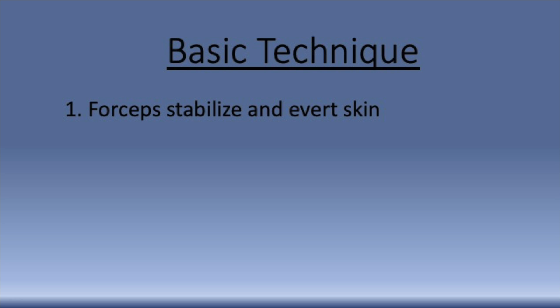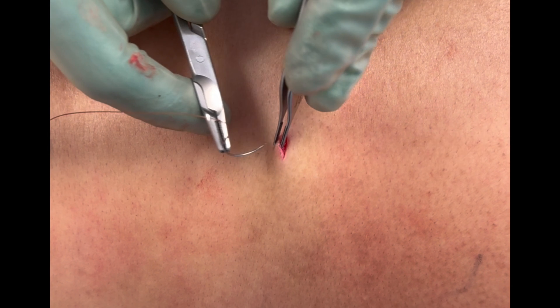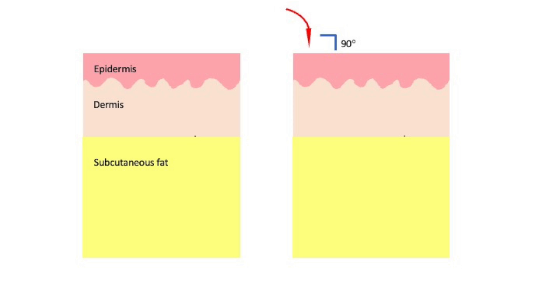The first step in this and really any suture technique is to use the forceps to stabilize and evert the skin. Note in this video how the forceps are actually folding the skin backwards towards the needle. This is very important because it allows the needle to enter the skin at a 90 degree angle.